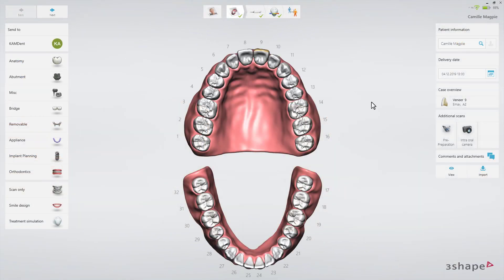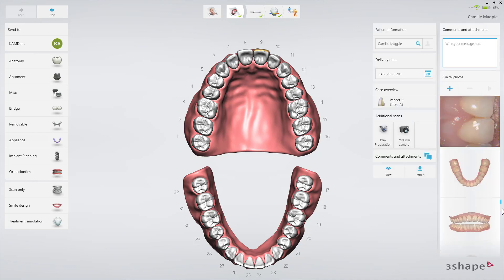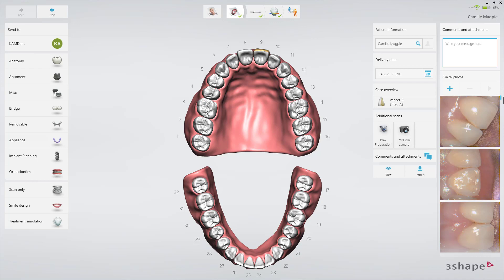The HD Photos are automatically attached to the order and can be viewed by the dentist in the comments and attachments tab, and also by the lab when they receive the order.